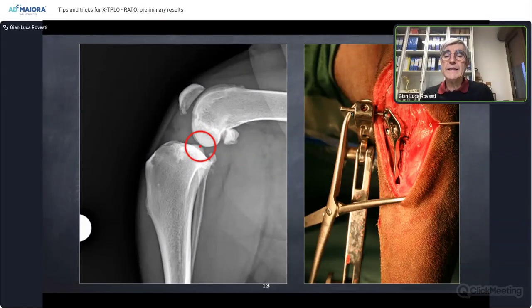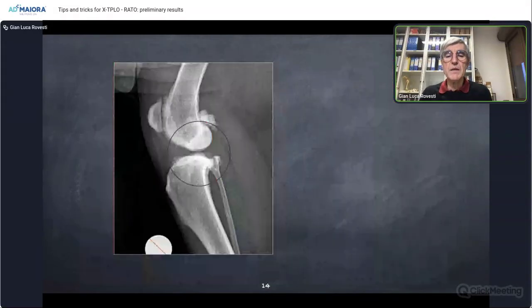So it is absolutely crazy to think about the option to insert this pin here in the center. This implies that we must put the pin, if we want to use the jig, in a different location that is, of course, in solid bone into the tibia.